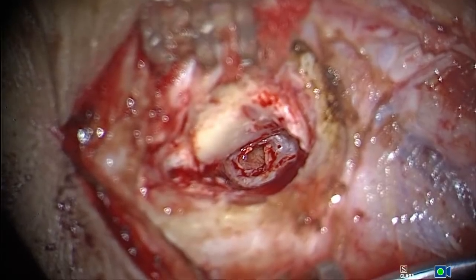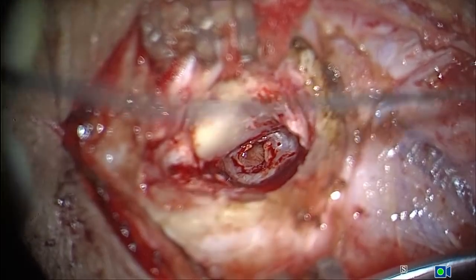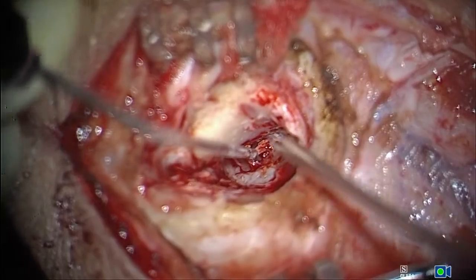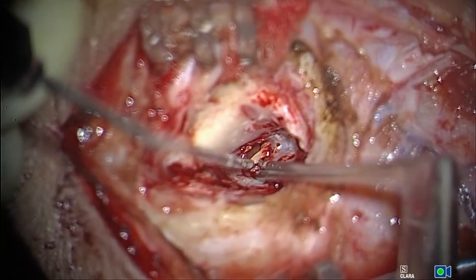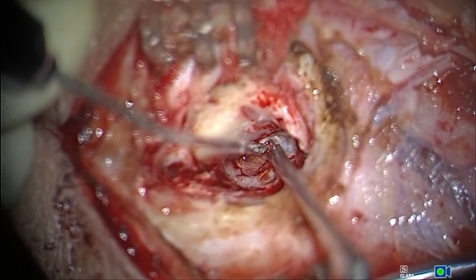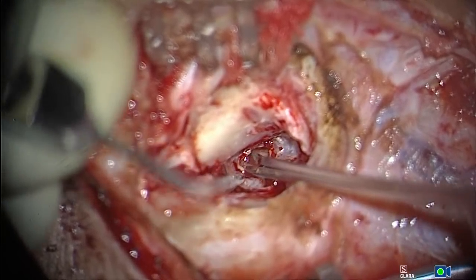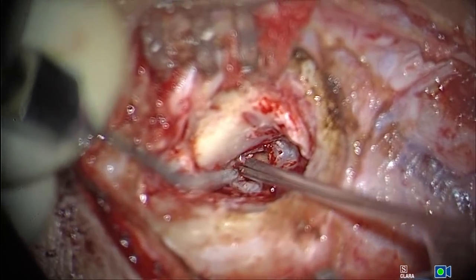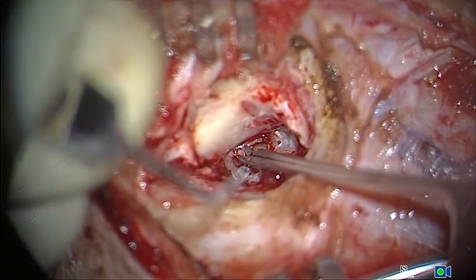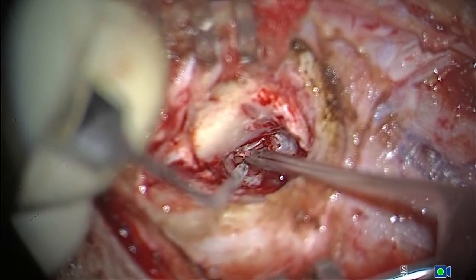Okay. Sharp cuts, so the perforation doesn't become a subtotal perforation. I have seen people converting a small perforation into a subtotal perforation. I really don't know why they do that. Use good sharp cuts, you will get a beautiful margin. To me, the best instrument would be the hockey and the scissors.